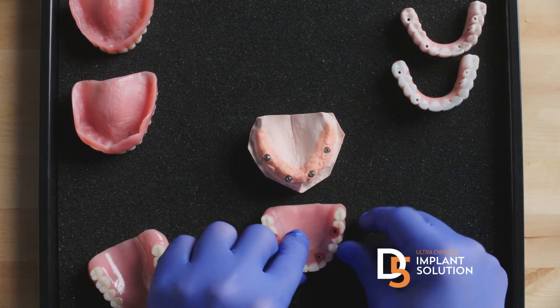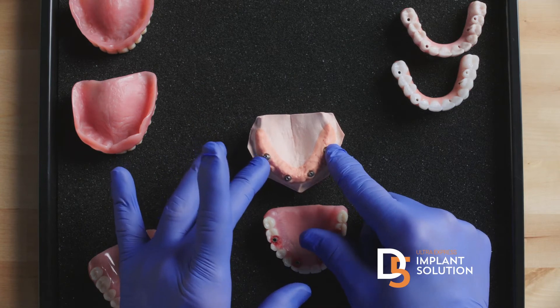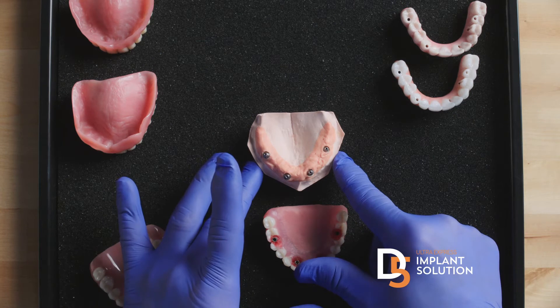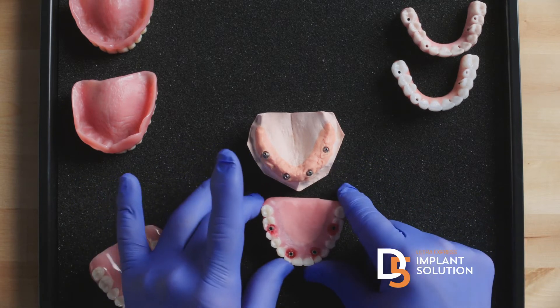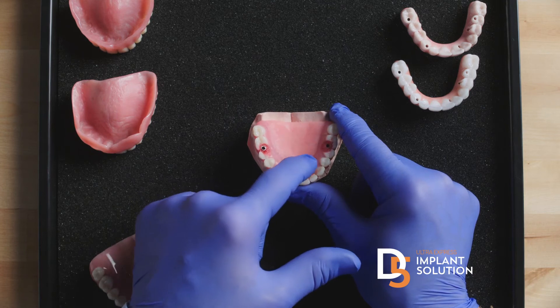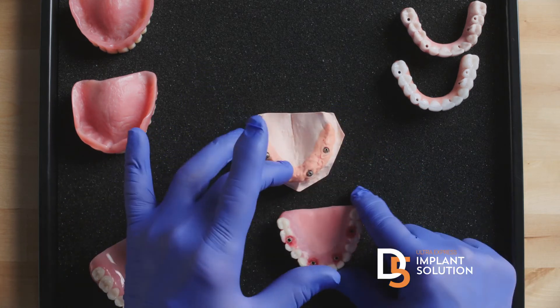Why that's critical: the whole teeth-in-the-day approach, or immediate load, where you splint implants together, is based on the fact that once you splint them together, it's critical during the healing phase over months that this never comes off, because the physical act of taking this off can make the implants fail. From doing thousands of these, when these were breaking, we were always trying to jury-rig how to fix it — because they were breaking so often — without removing it and causing implant failure.